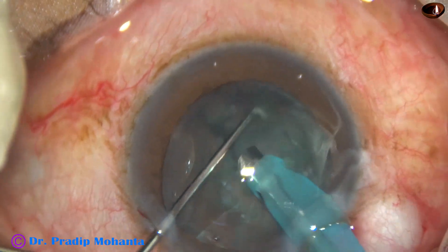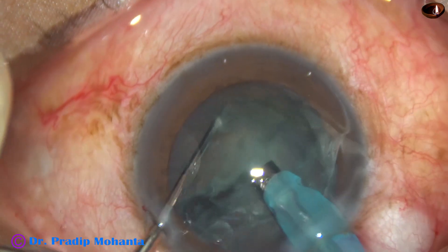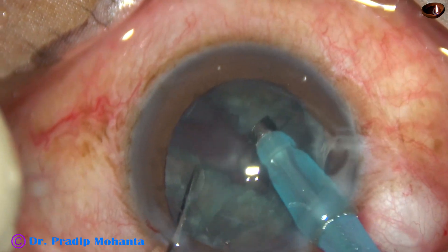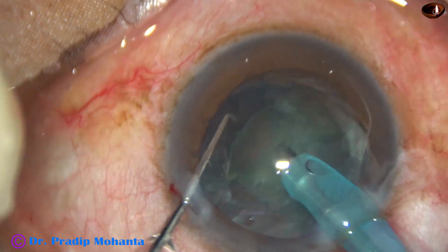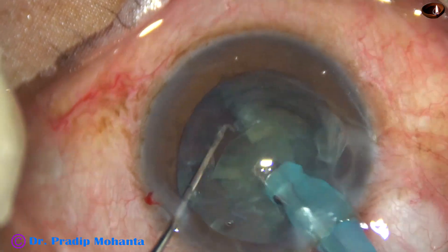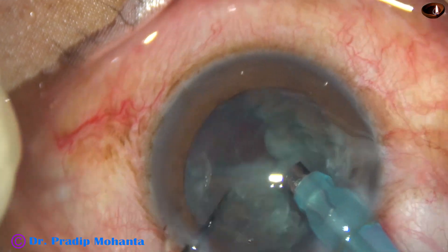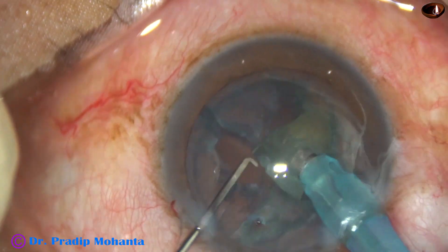And here it is. Just place it there and use the chopper. The FACO needle just supports the lens mass in front and the chopper does the job.